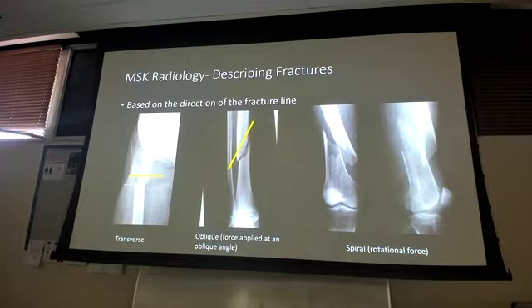So that was one of the questions that I wanted to clarify. And then the other one was about the ultrasound. What's Doppler versus duplex, the quantitative flow? You can get pretty deep with this when you add the two together. With the Doppler and the quantitative, you can check the velocity of the blood going through the vessel and stuff. Listen, stay in the lily pads for this, okay?